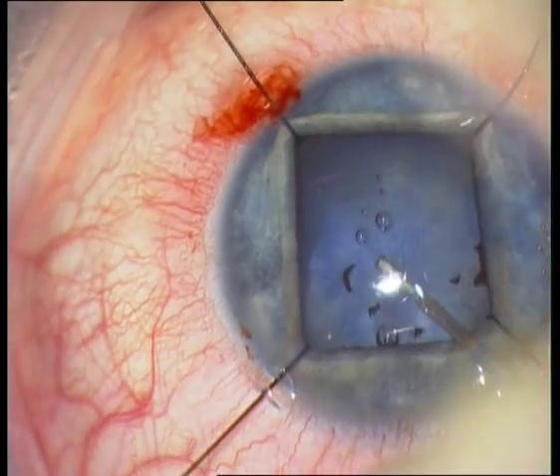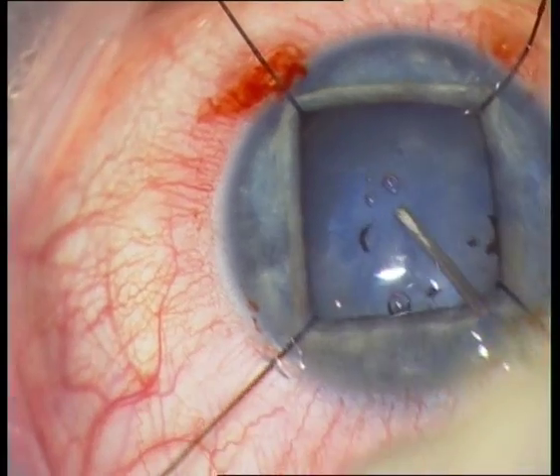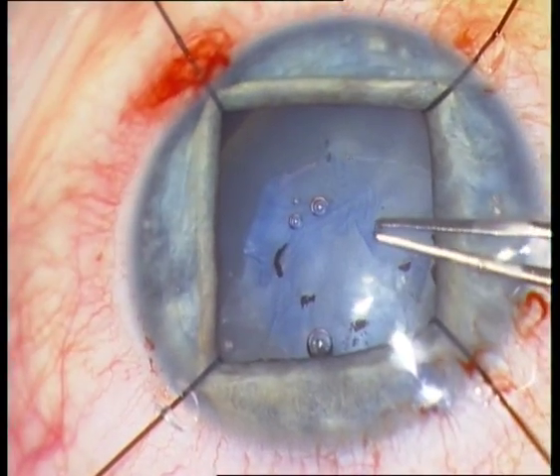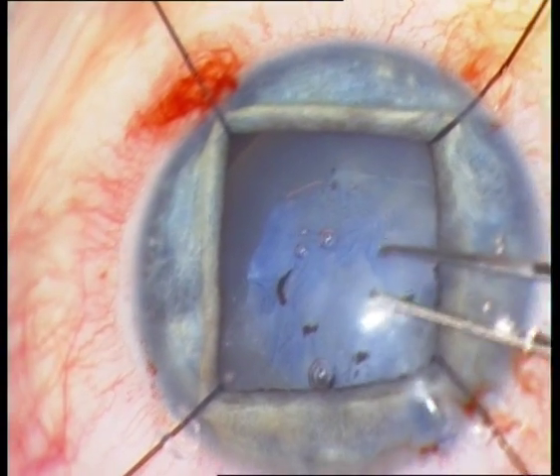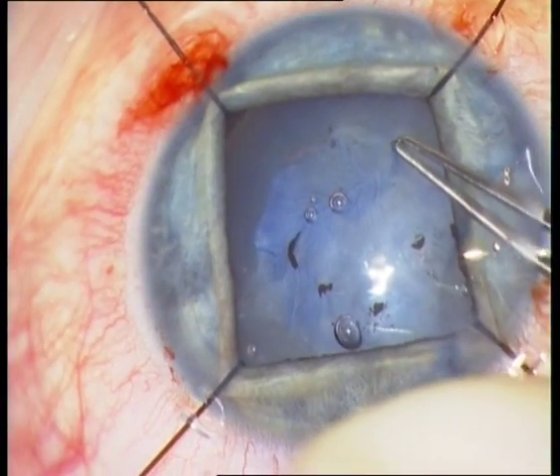I am trying again to open the anterior capsule with the cystitome, and I do not succeed. The anterior capsule is very, very thick. The next step is the capsularhexis forceps.